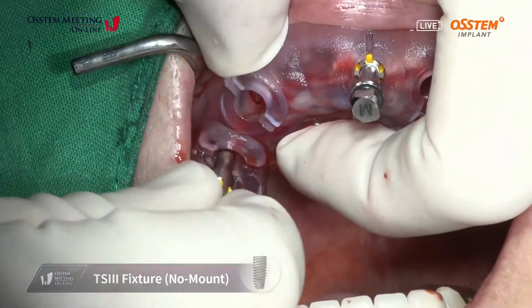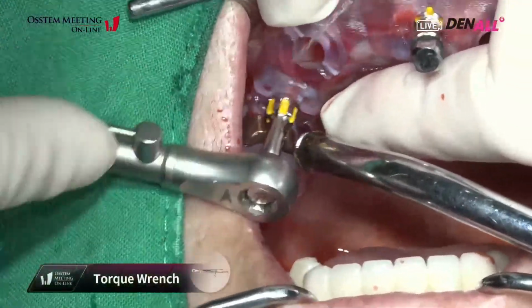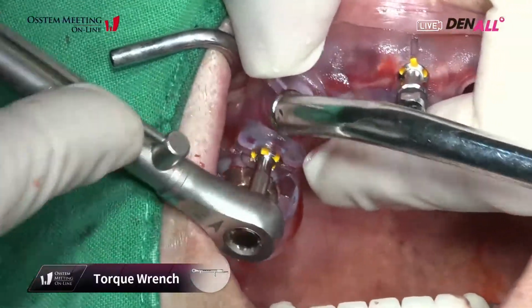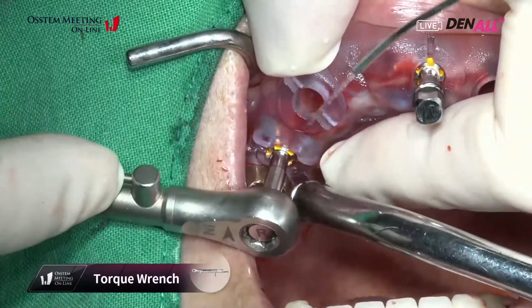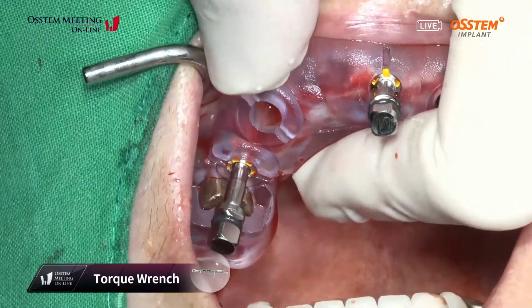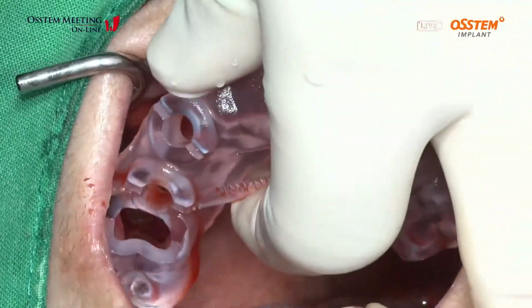Because I performed undersized drilling, the initial stability is quite good. Yeah, the depth control was good. The implant placement was done. 4 implants were placed. Okay, let's check.